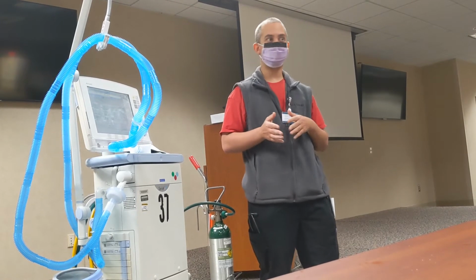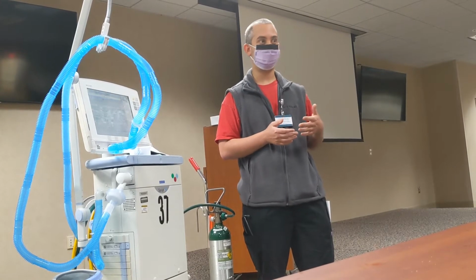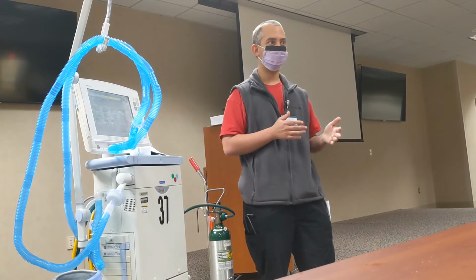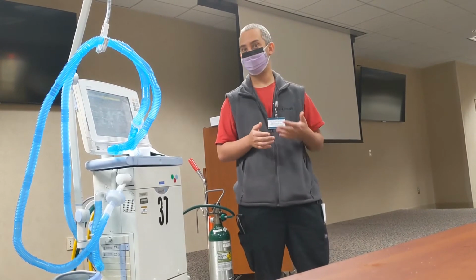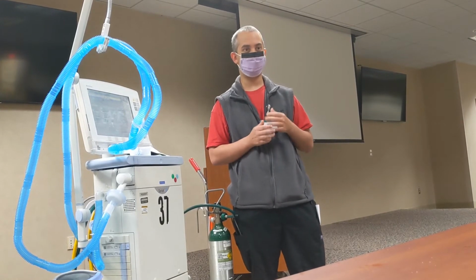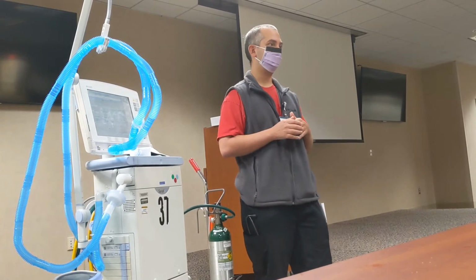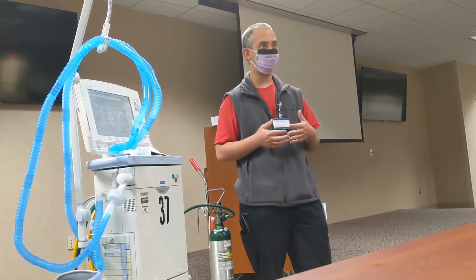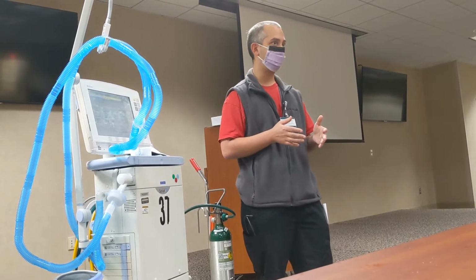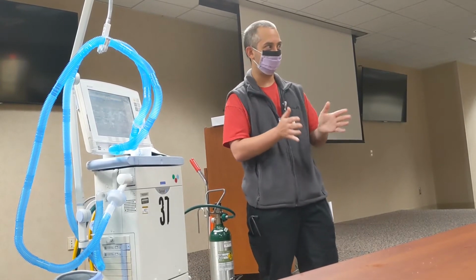And then having a T low too short, you can have a little bit of air trapping to go along with that. So you don't want it too short, you don't want it too long. 0.5 is about the average for most everyone. COPDers may need it a touch longer. Interstitial lung disease or fibrotic lung disease with some restriction may need it a little bit shorter because their lungs are going to want to elastic recoil really quickly.